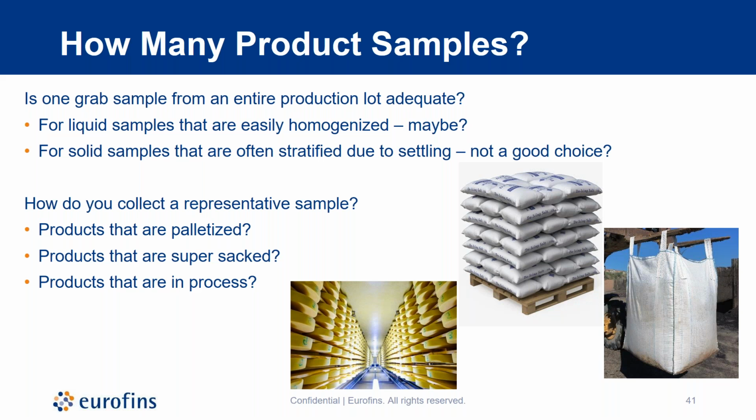The labs, they don't care about the sample. They assume that whoever collected the sample, that the sample is uniformly representative of the entire production line. And that may or may not be true. And so when people blame the lab for a bad result, be careful, because it may be nothing more than a reflection of a poor sampling plan by the people who were collecting the samples.